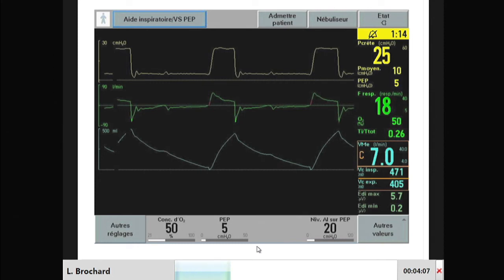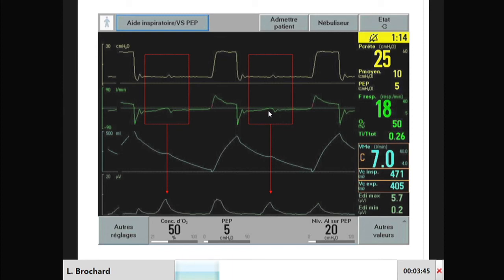This is a nice example because you have pressure support ventilation, which looks very regular and very nice with a respiratory rate of 18. If you have a good eye, you see that these small changes in airway pressure and flow may be something else. And in fact, when you have the diaphragm EMG, you realize that there were 2 missing breaths here. So the real patient respiratory rate is probably more than 30 to 35. And this is an example, if it's over, let's say, 3 minutes, that would be a cluster of asynchrony.